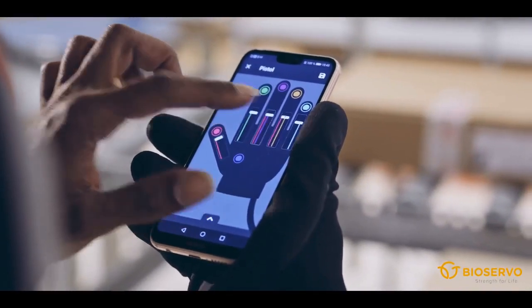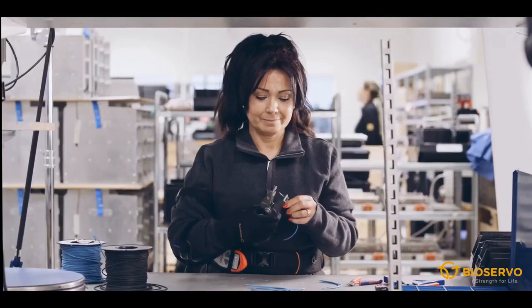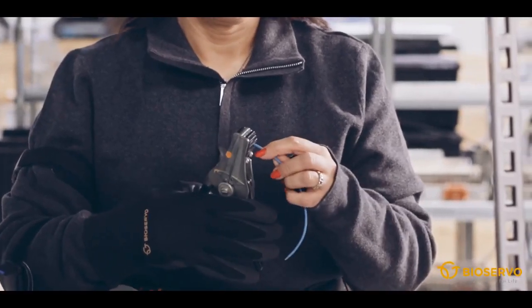Ironhand comes with different carrying solutions to enable an ergonomic option for different working positions. The system is suitable for grip-intensive work tasks where the hands are exposed to high forces, repetitive or static work.